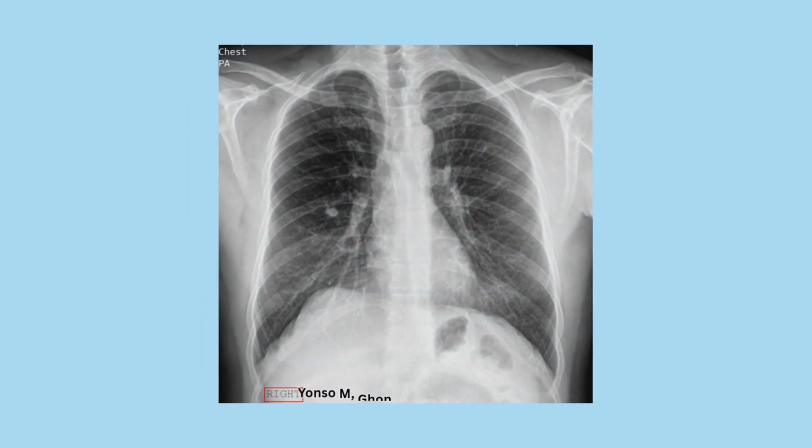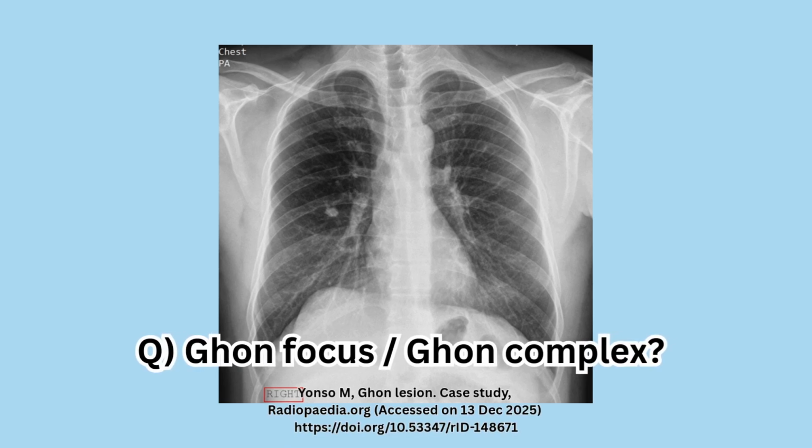Now for the final question. What are the Ghon focus and Ghon complex, which are commonly seen on chest X-rays after a primary TB infection?